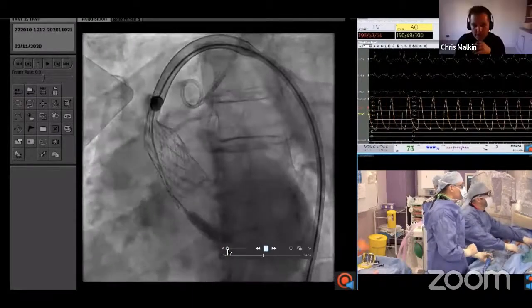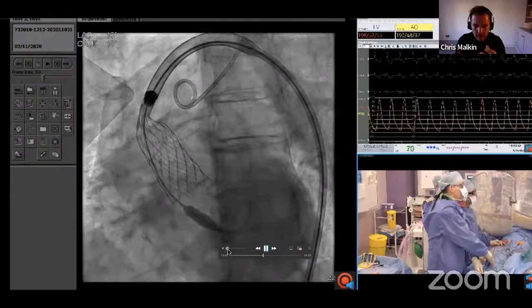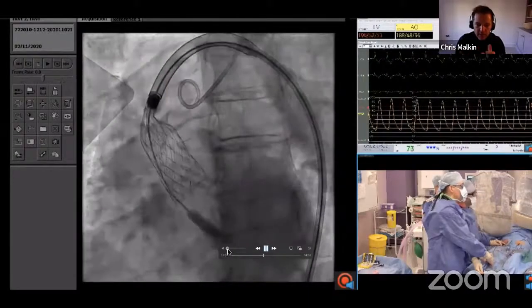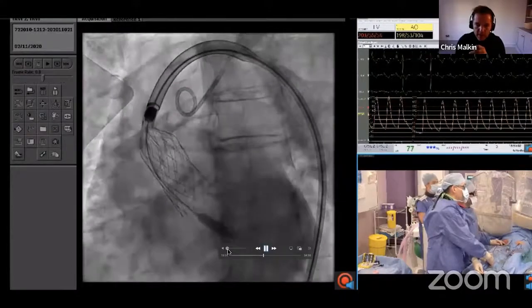So there's no rush at this point. The valve is expanding all the time. The temptation is you just want to finish the procedure, but actually this is the time to go very, very slow. The valve is in perfect position. You don't want it to move. So we are just taking our time here.